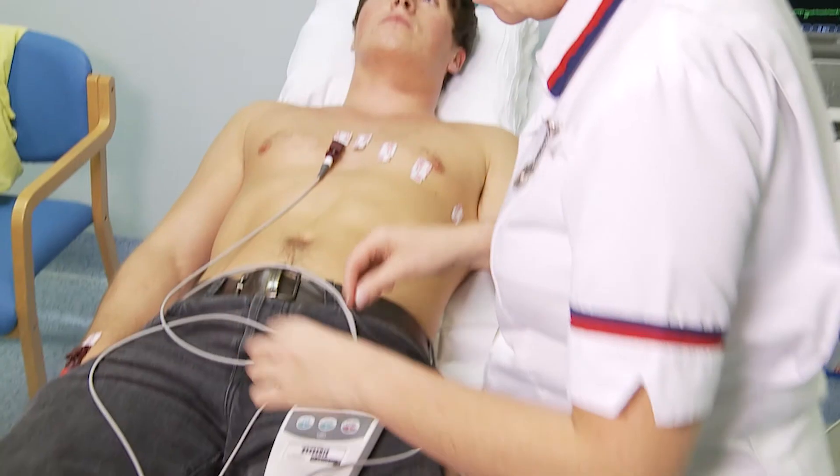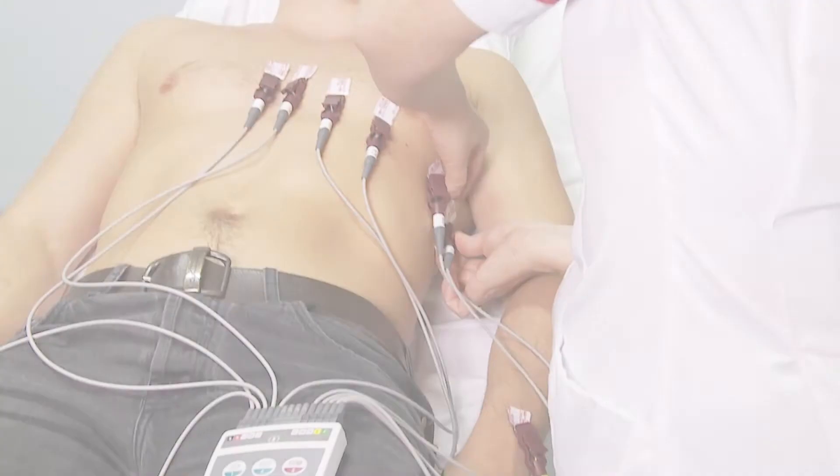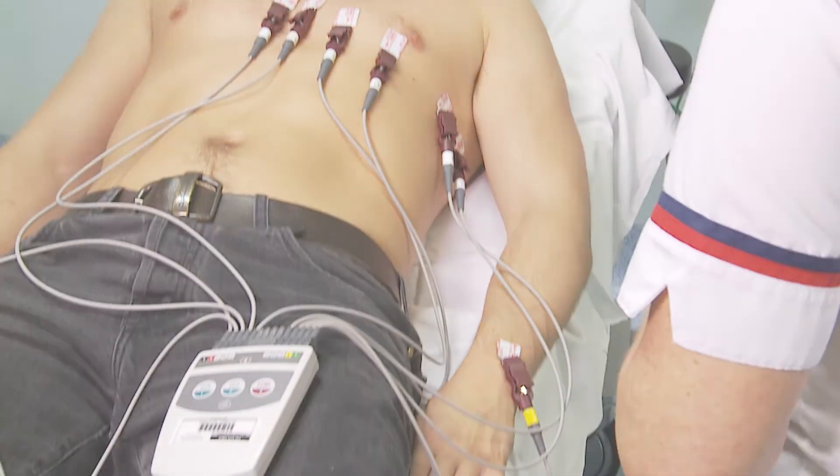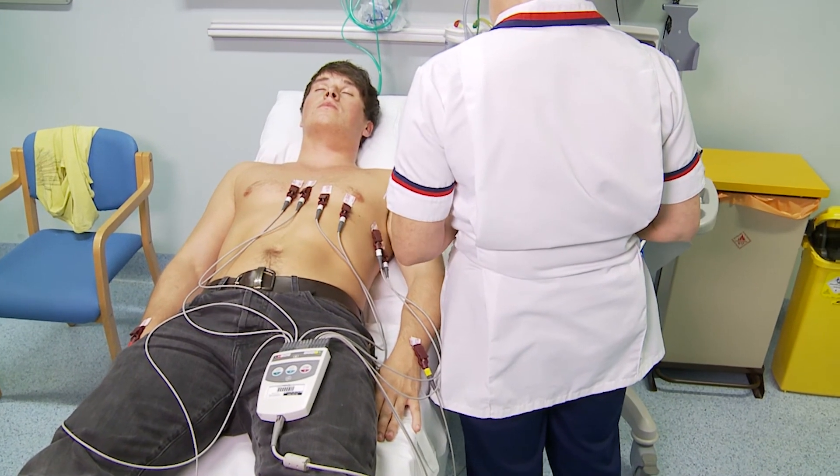Now move on to attach the chest leads to the corresponding electrodes, C1 to C6, from the patient's right to left. Now the leads are attached, you're ready to take the ECG recording.